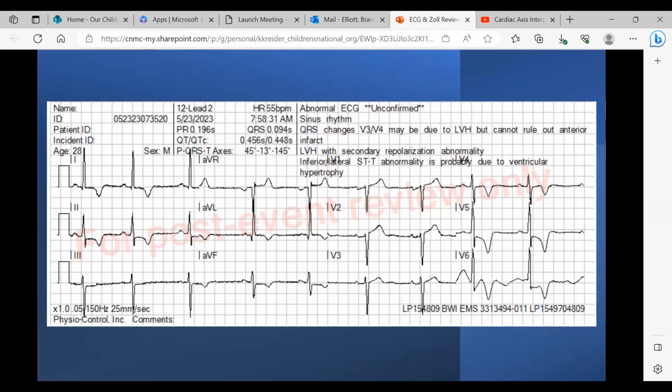So, a 28-year-old male, only complaint of diaphoresis and no previous cardiac history. Was this your patient? What would you determine? Would you consider this cardiac in nature, or medical history, or physiology versus pathophysiology? Being that young, probably not cardiac in nature. It could be patho, or it could be some sort of previously undiagnosed condition, especially with the potential of a block or left ventricular hypertrophy.